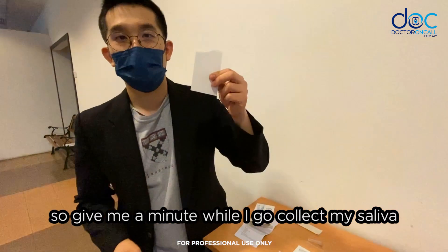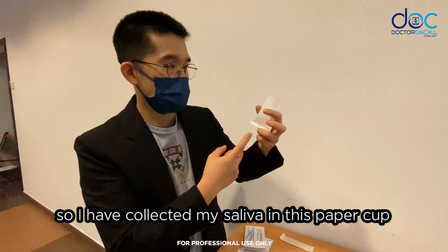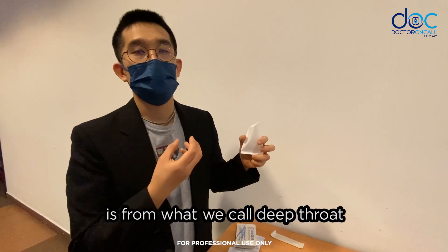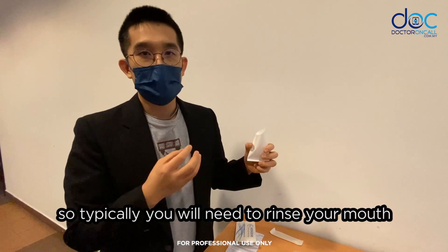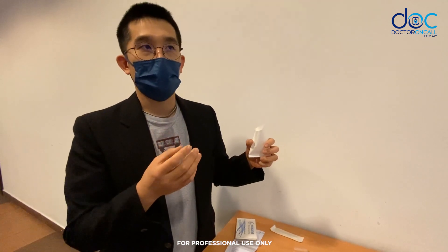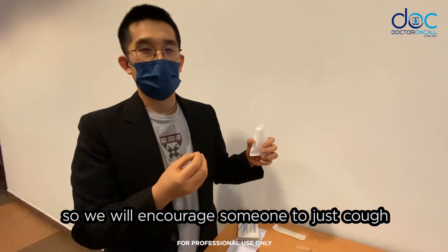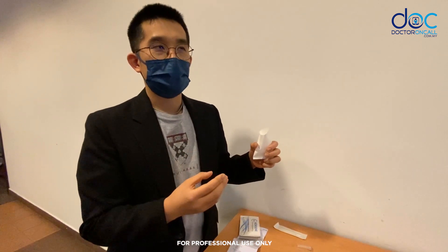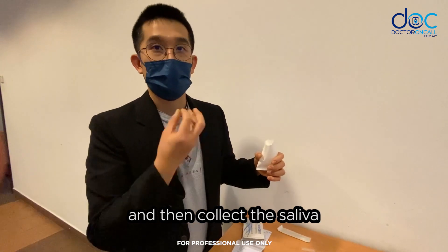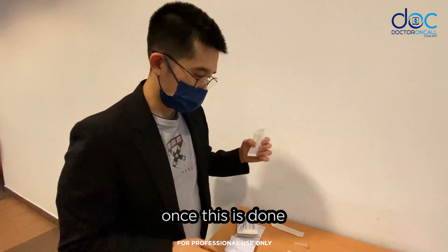I'll collect my saliva now. The saliva being collected must come from what we call deep throat, or the back of our throat. You will need to rinse your mouth and not eat for about half an hour prior to doing the test. We encourage you to cough in an area where there's no one around, then collect the saliva and expectorate it into the cup.